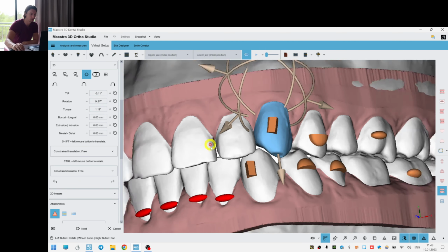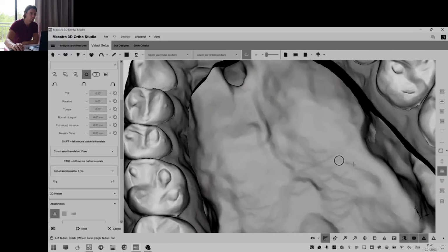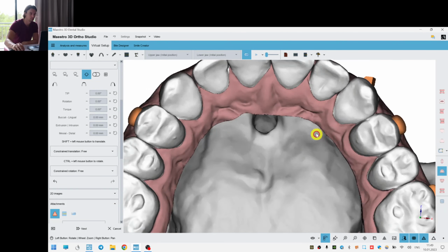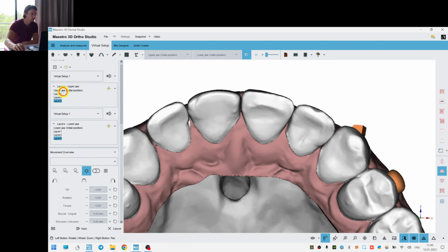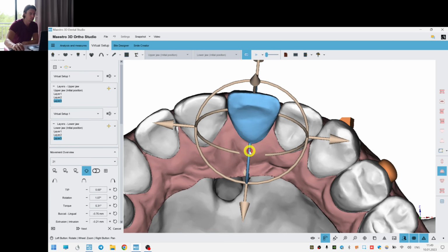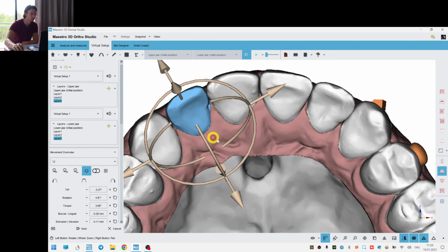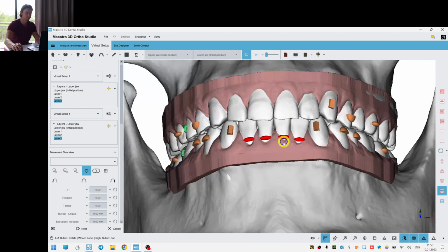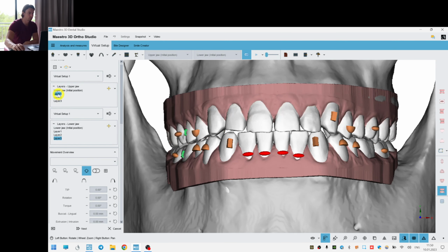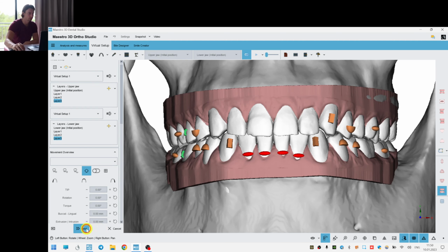Set for all layers. Still get some gap here. Let's check if we need some more correction on the upper teeth. I think we've already done it. Maybe we should even reduce the degree of the correction here. Let's check the attachments between the layers. Are we correct? Yes, we are. Now let's go to the models builder module.